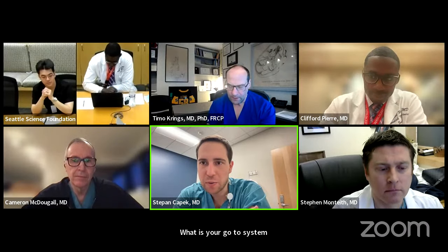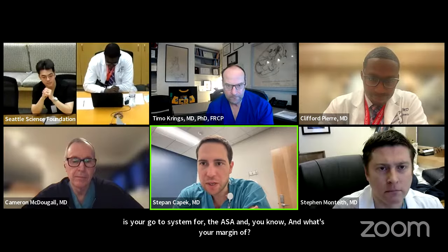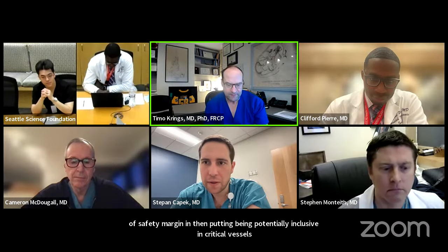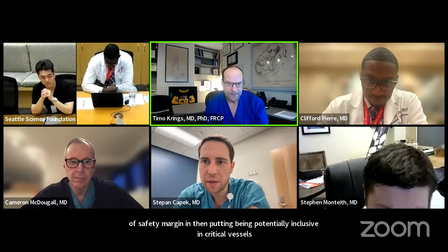I have a question. What is your go-to system for catheterizing the ASA, and what's your margin of how much do you trust monitoring versus what's your kind of safety margin in being potentially occlusive in critical vessels? Yeah. So my go-to equipment is still, and has not changed, the Magic 1.2.